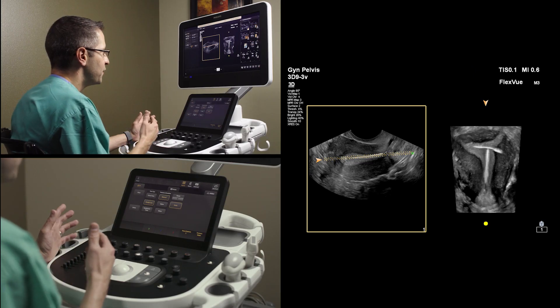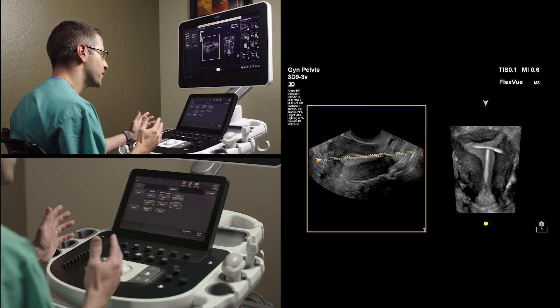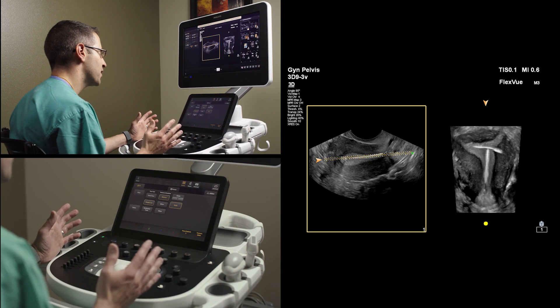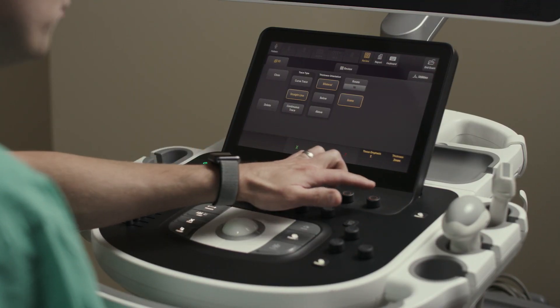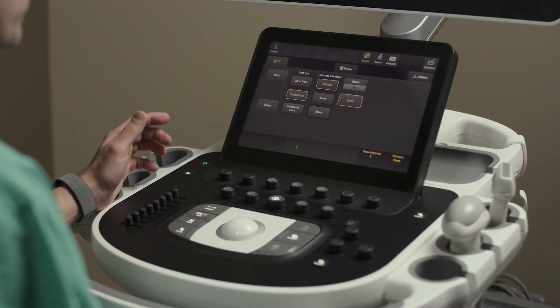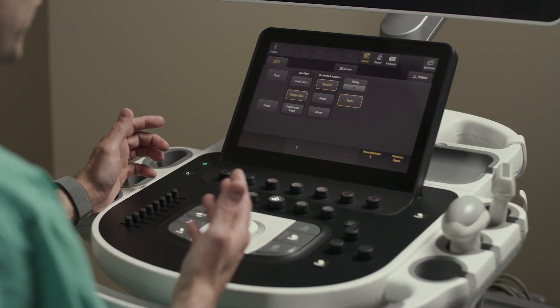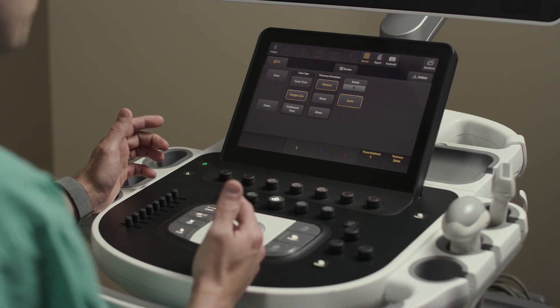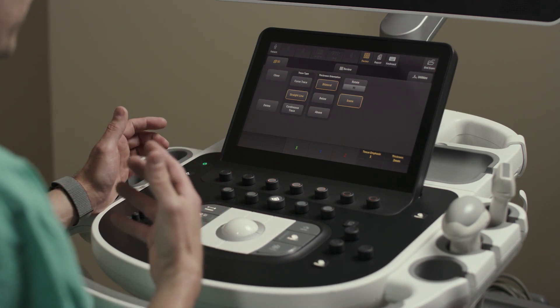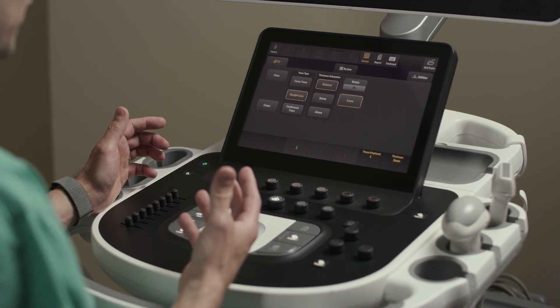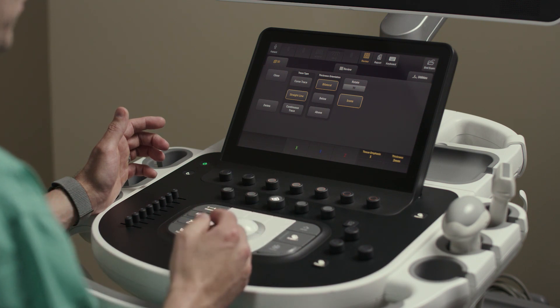This FlexView feature incorporates a couple of different selections available in these two rotary knobs. One of those is intensity projection, which can go from maximum — labeled here as one — or minimum.